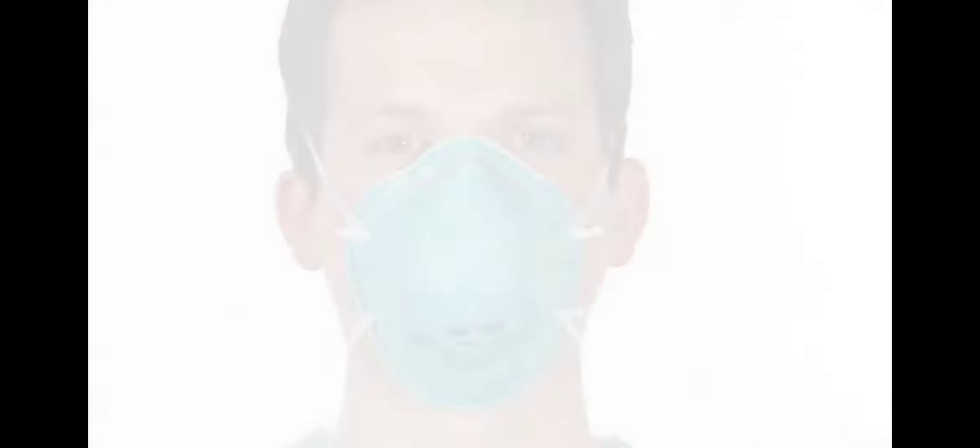The 3M 1860 is a cone-shaped particulate respirator and surgical mask. The 1860S is a smaller version of the 1860. Follow these instructions each time you don your respirator in order to achieve a proper fit.